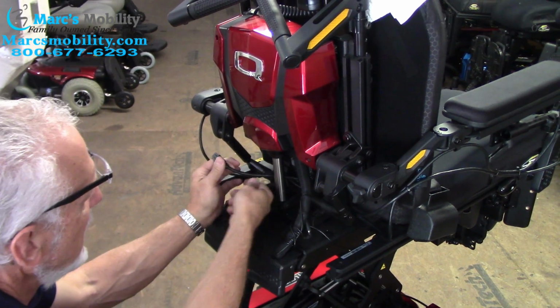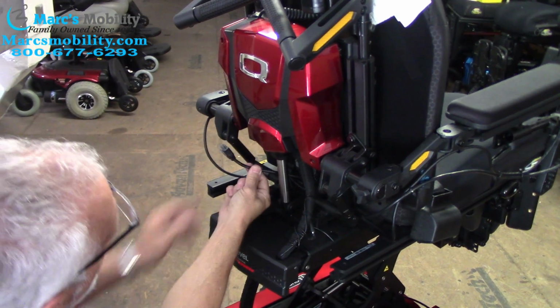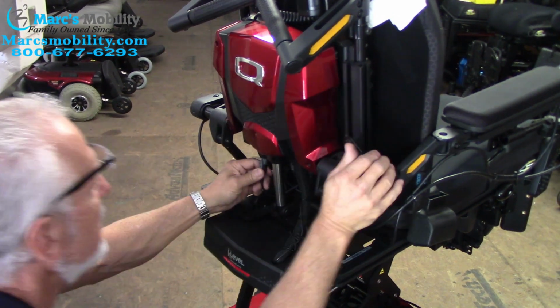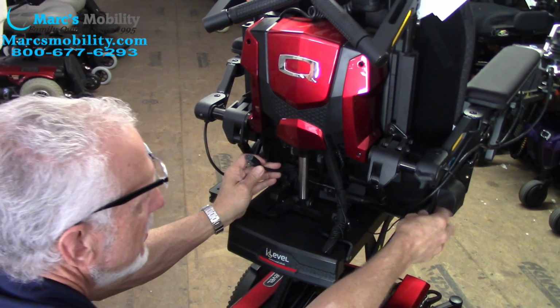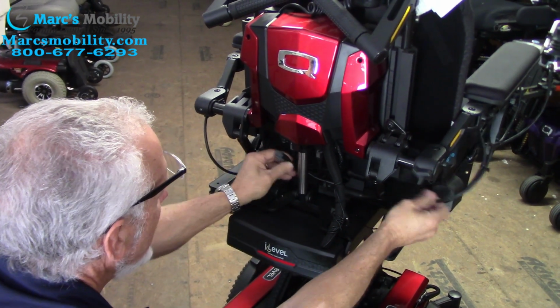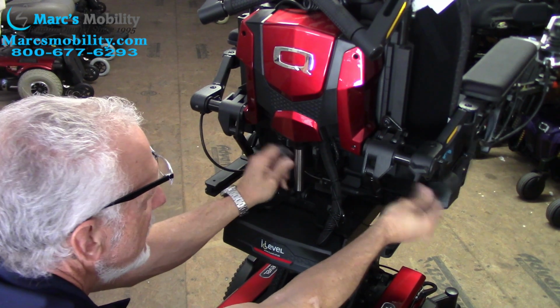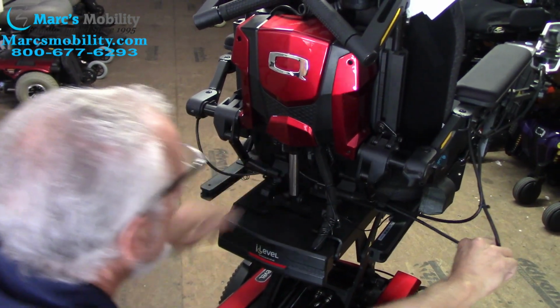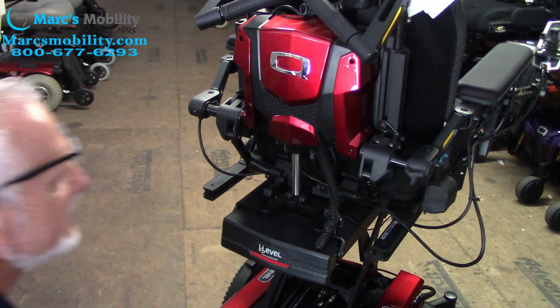You don't need that little, there's a sticker sitting right about where my fingers are at. It's about that big and it sticks out. Cut it out. Unplug the cable. You'll be able to tell when you pull the joystick cable, you'll be able to tell right here by doing that. You've only got one cable, so unplug it there, pull it through, okay, so it's out.